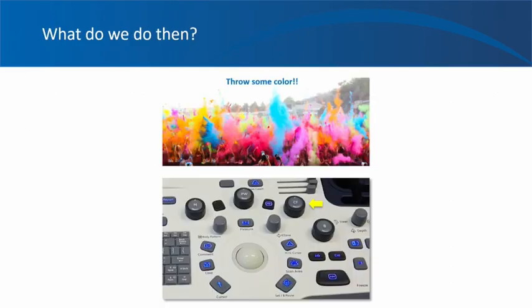When you find something suspicious for a stone but you are not sure, just turn on the color button on your machine, take the color box to that area, and see what happens.